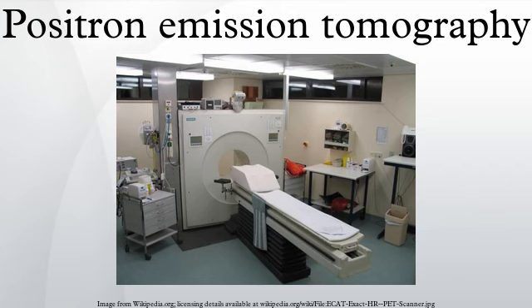3D techniques have better sensitivity and therefore less noise, but are more sensitive to the effects of scatter and random coincidences, as well as requiring correspondingly greater computer resources. The advent of sub-nanosecond timing resolution detectors affords better random coincidence rejection, thus favoring 3D image reconstruction.